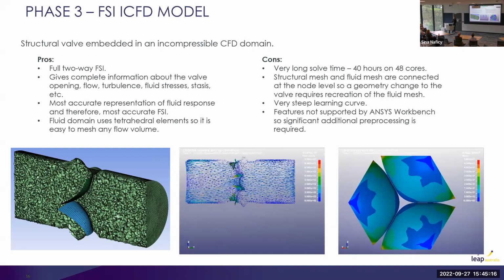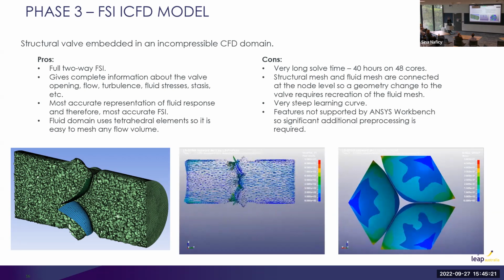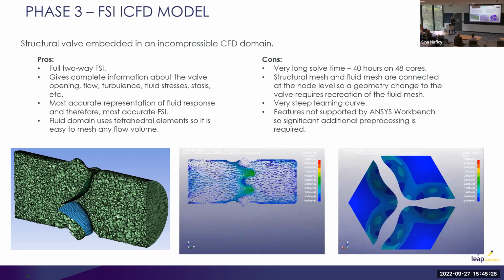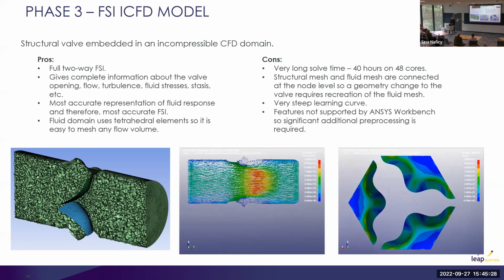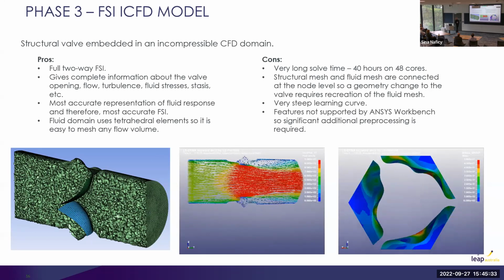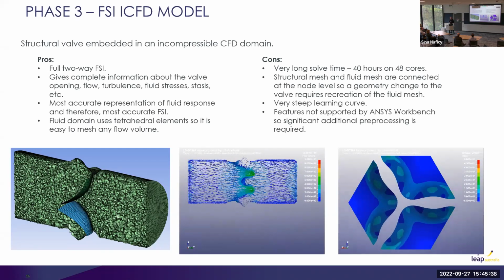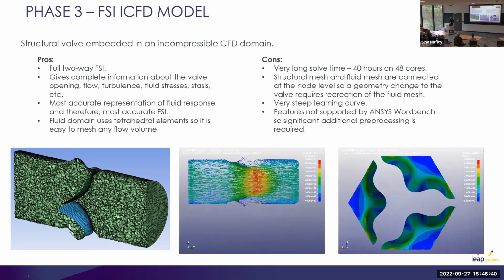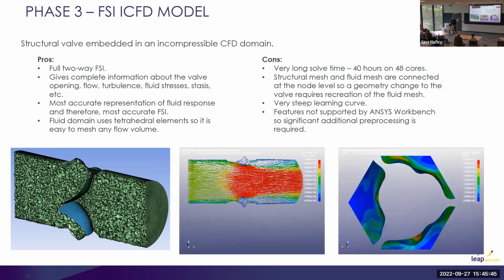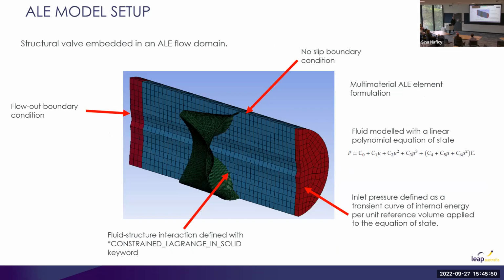Sina's going to come to me and he's going to say, how do I do this crazy stuff in the valve, with weird distributions of thickness and reinforcement here and there. And then we go back to work and we work out how to do that. And then we'll get much more realistic behavior. Like you can see where the valve closes, there's kind of a gap in the middle. That's not realistic. That's because in bending, this is too stiff because it's a linear elastic material model, whereas a hyperelastic material model wouldn't do that. So yeah, as I said, trigger warning for the material scientists.